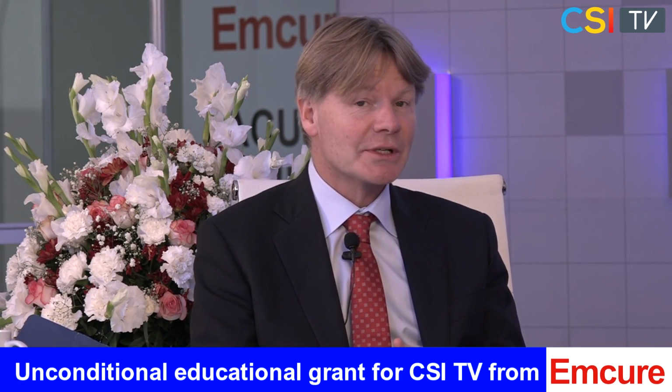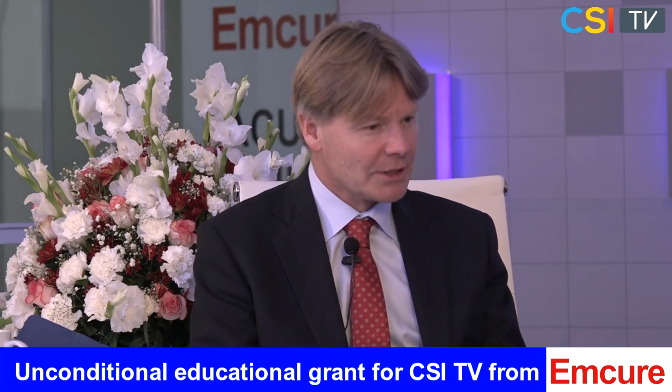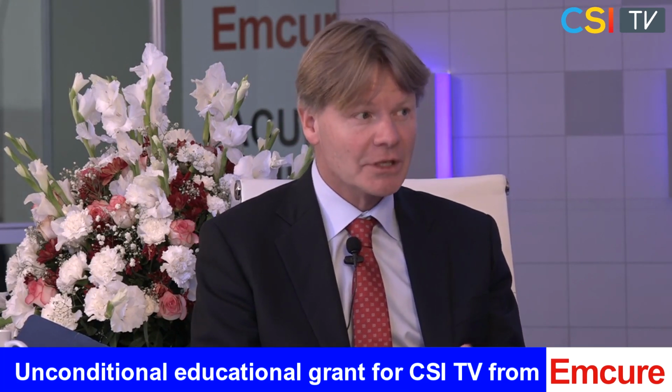So we can do either functional imaging, or we can do ischemia imaging in terms of perfusion imaging. You can do that with any technique. You can do that with a nuclear scan, you can do that with an echo, and you can do it probably at the highest resolution with an MRI. And if your question is specifically which territory is the problematic territory relating to this or that vessel, then probably your first choice would be an MRI. I know that from the DANAMI sub-study, they have one article coming soon on the use of this.